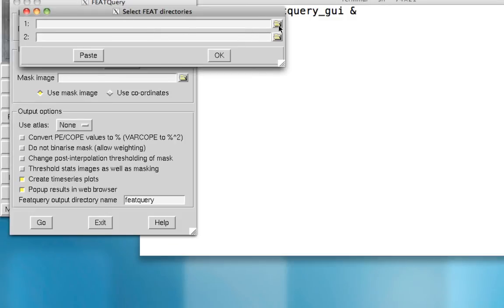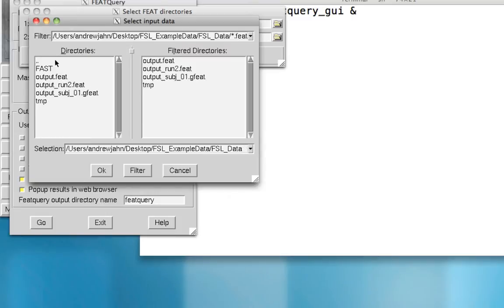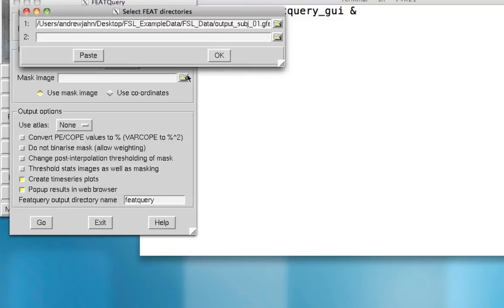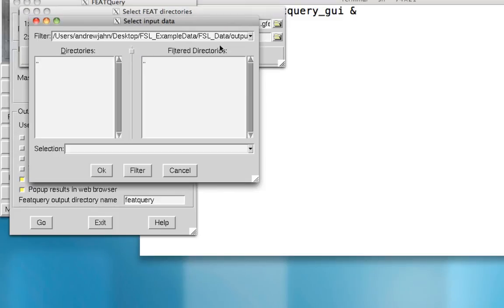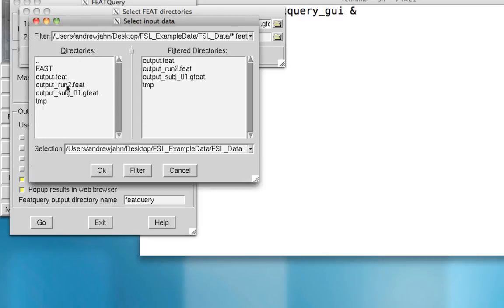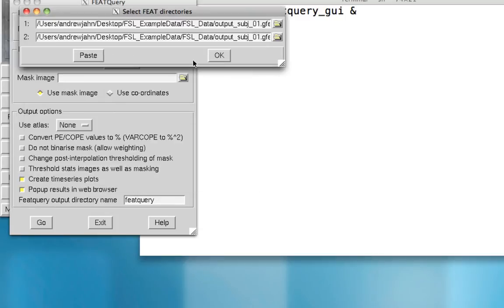I go here and I select this cope1.feat directory. That represents my contrast of left minus right. And for the other directory, I'm going to load in cope2.feat, which represents the contrast of right minus left.